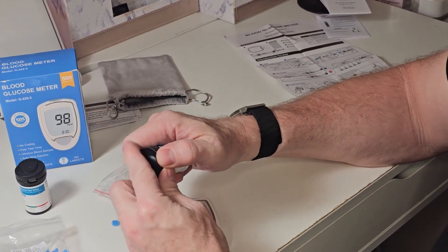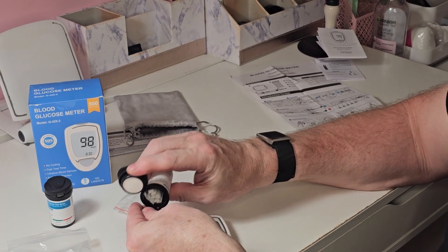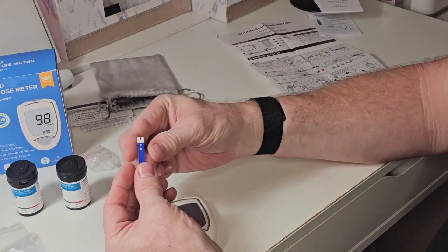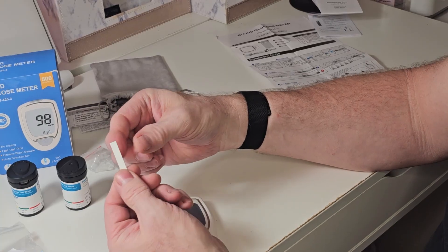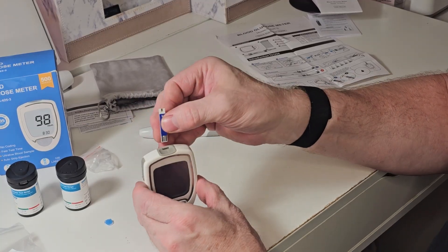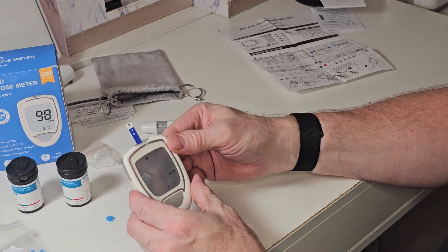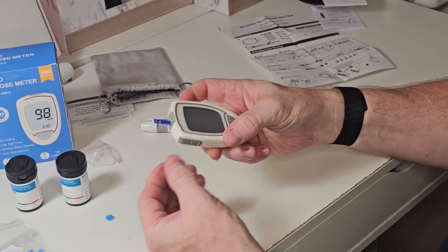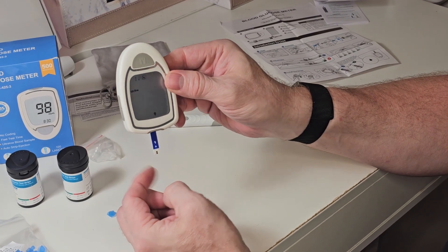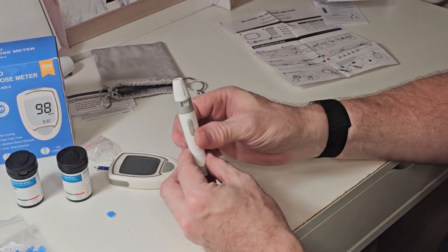Now let's get the meter set up. Go into the container and get out a test strip — make sure you only have one. This is where the blood is going to soak in. Load the test strip into the meter like this, which will automatically turn the meter on. After you have a drop of blood ready, position the meter like this and it will soak the blood up.